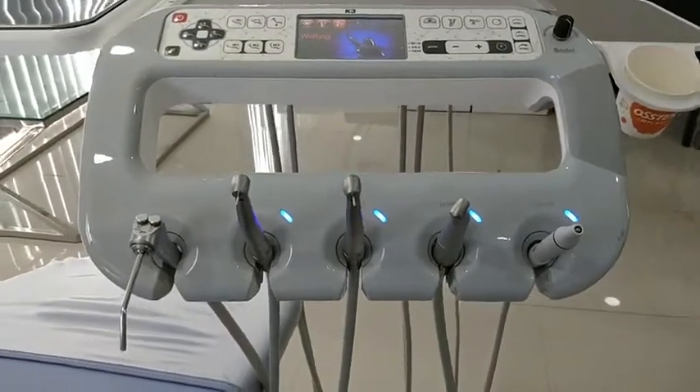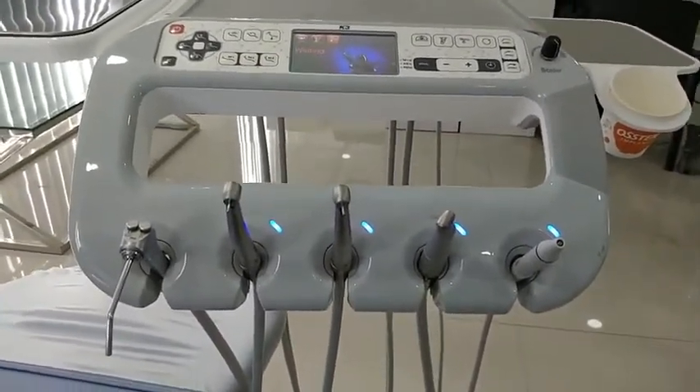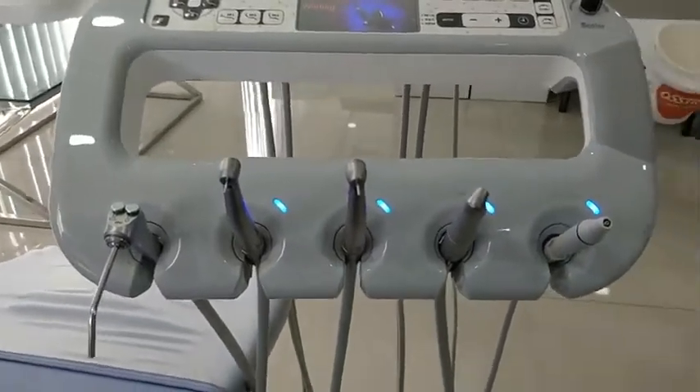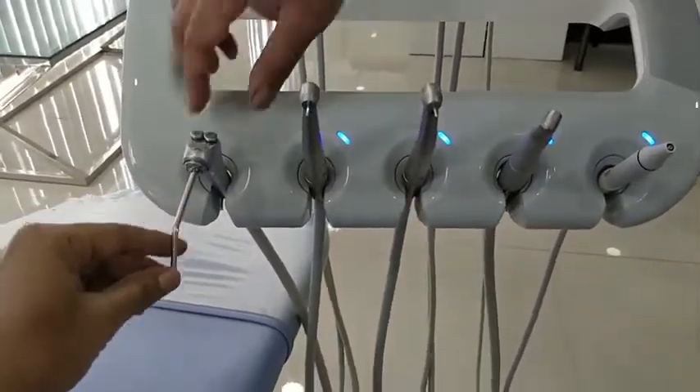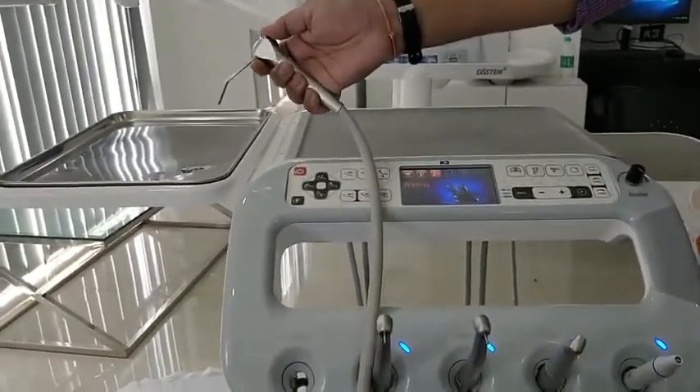Now let's look at the attachments provided with the chair. First is the three-way syringe, which can be used for air and water.